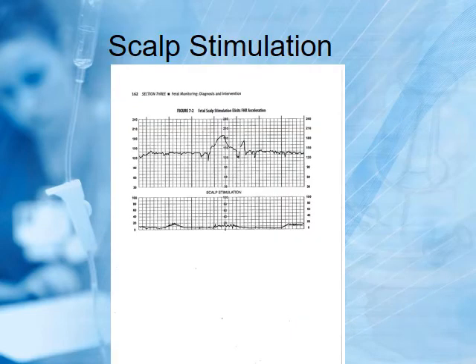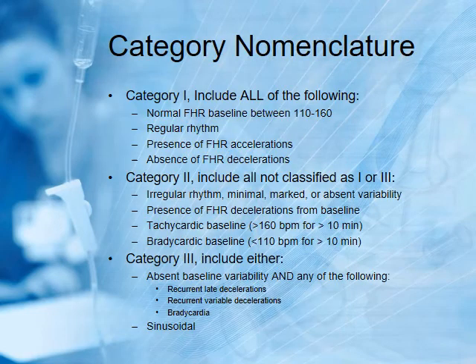Here's the result of scalp stimulation. Boom, goes up quick. Stimulated here. It says, what are you doing to me? That's good. Good response.